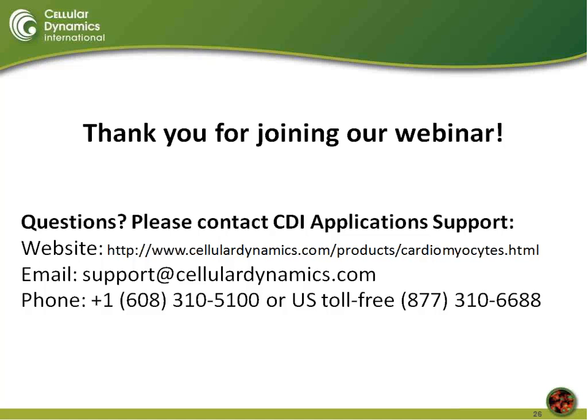All right, and another question that we have is, can these cells be cultured on Matrigel? That's actually a great question. We haven't discussed the extracellular matrix that we typically use with the neurons, but the recommended matrix is a PLO laminin double coat. And this is something that is gone over, and there's a protocol for it in our user's guide.